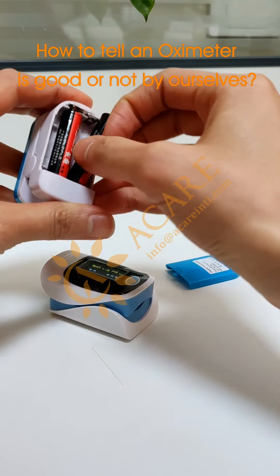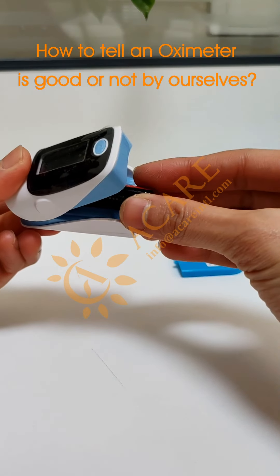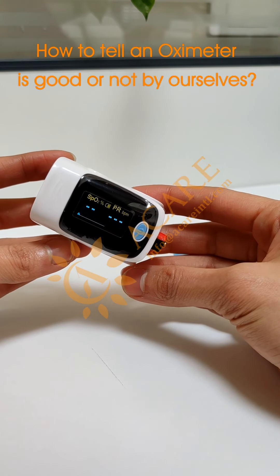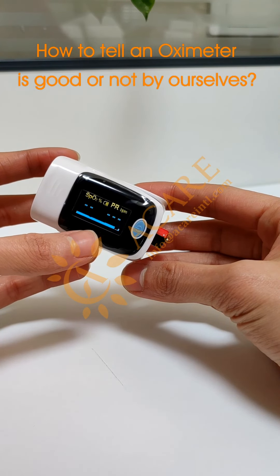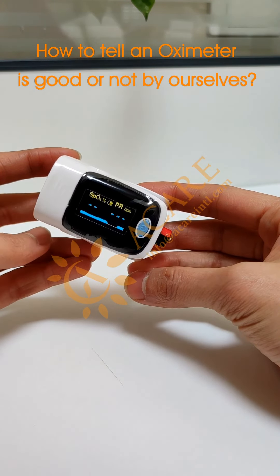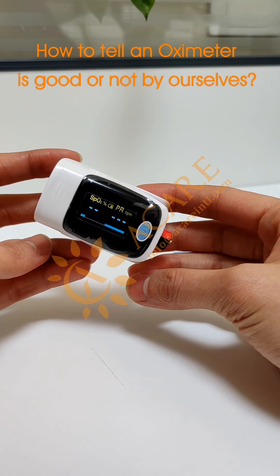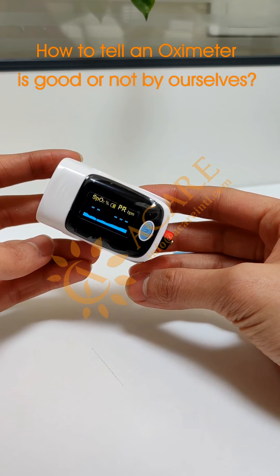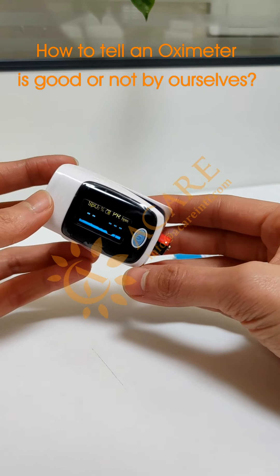Let's do another experiment. Now I will test this battery — it is like a finger. There are no waves and no reading. Let's wait a few more seconds and see. Still no reading.